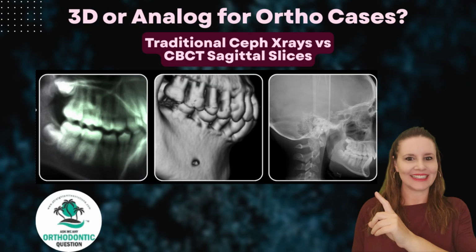And we're going to be doing a little more content shortly on the new CBCT integration with Clincheck 6.0 software, which I've been fortunate to be able to start to use with some of my doctors. Not everyone has a CBCT. It's also a bit time consuming to upload those suckers because they're big files into your Clincheck. I don't know that it's totally necessary, but for a really hard case, it's really nice. But let's not talk about that.